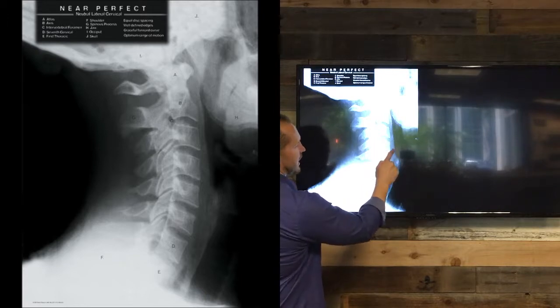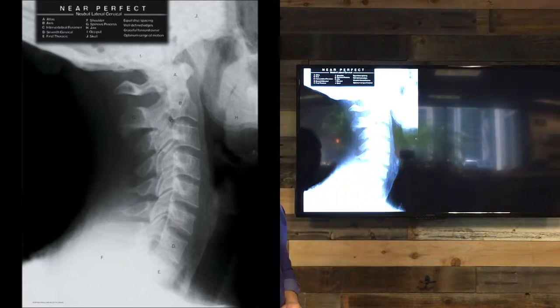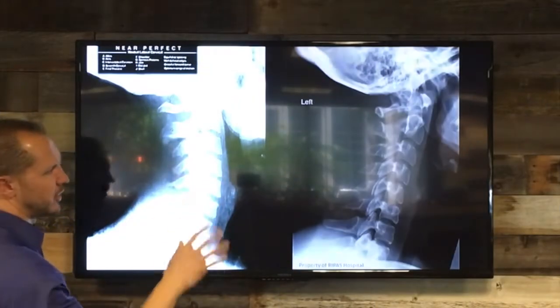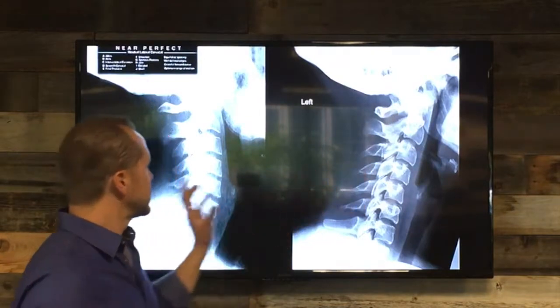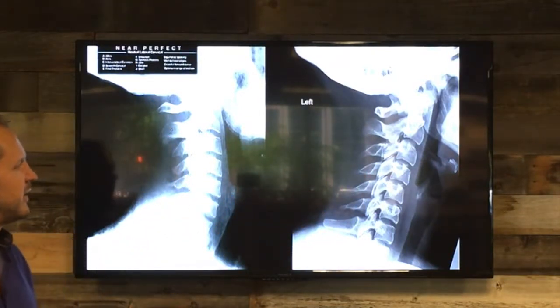Now also notice how smooth these little cubes are. These little cubes are the vertebral bodies. The smoother, the better. Now I'm going to show you another picture. Now you can kind of see visually they don't look the same. You don't have to be an x-ray specialist to see this.